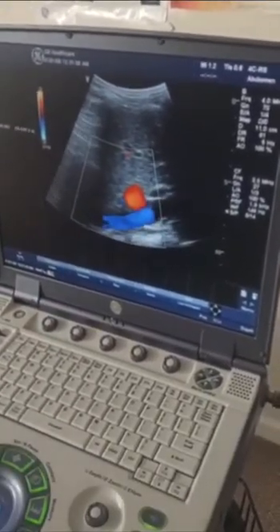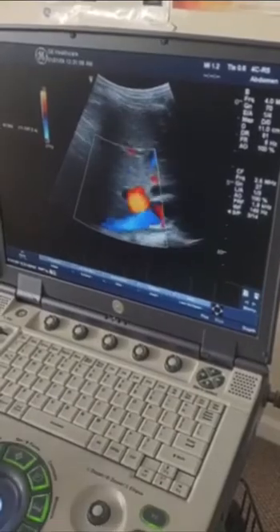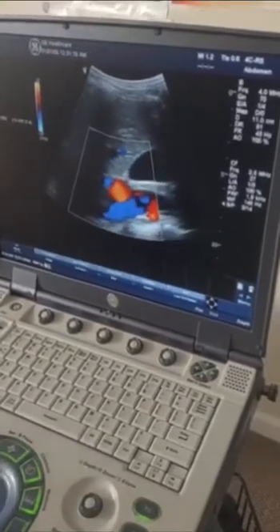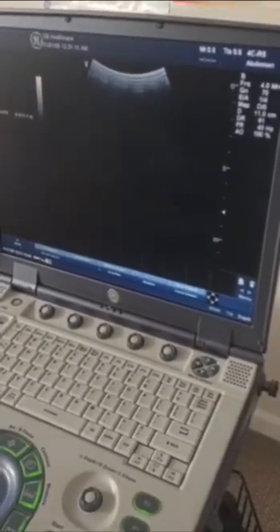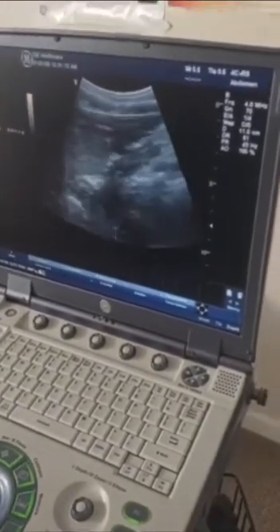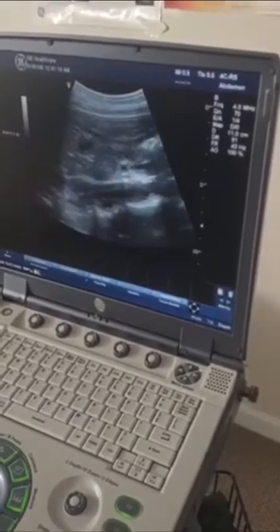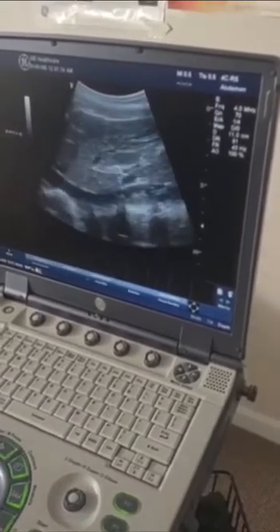Go ahead and breathe out. I sometimes like to use this view when I'm going anteriorly and I have a very gassy patient, which makes it kind of difficult to clean out the IVC. But again, this is your anterior view, and you can follow it down as much as you can.